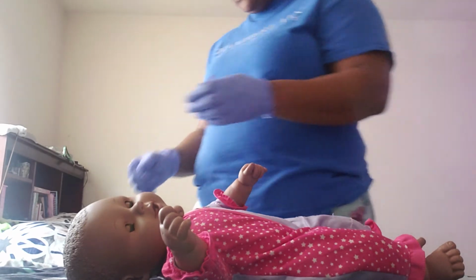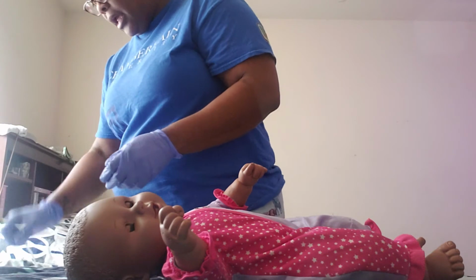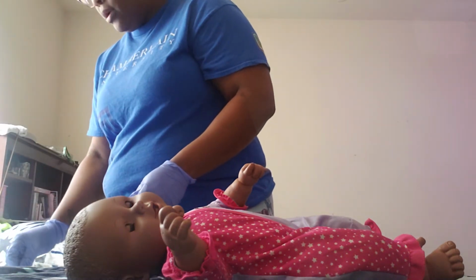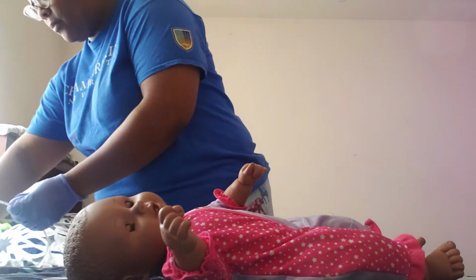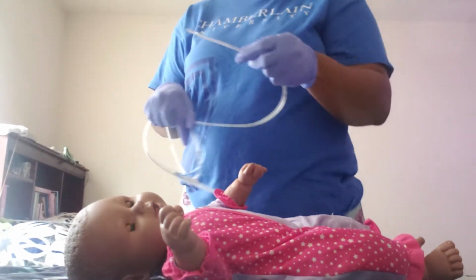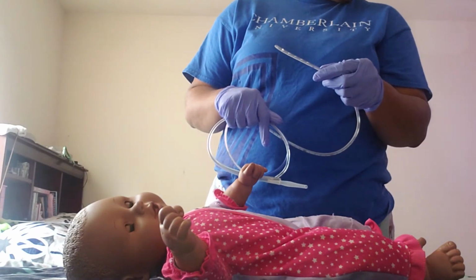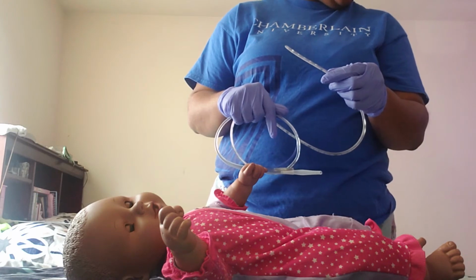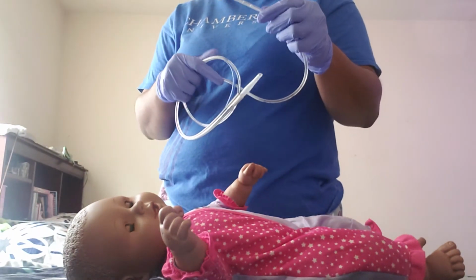And then I'll take my NG tube and I will place some lubricant on my paper here, and I will lubricate the first 4 inches of my tube. And then I will go ahead and let the patient know that they will have some discomfort there, and that I'm going to go ahead and start the insertion.